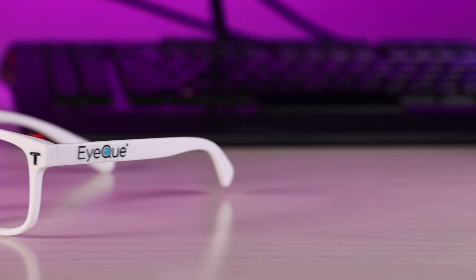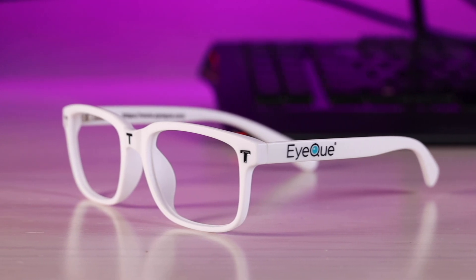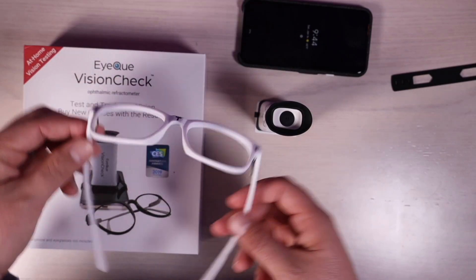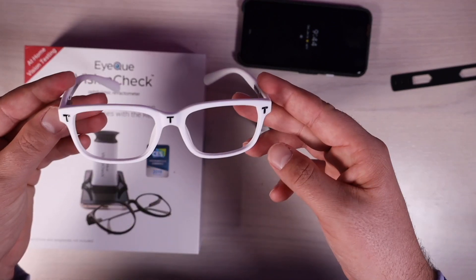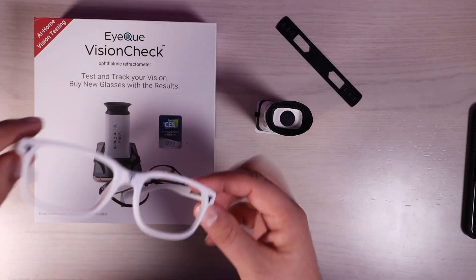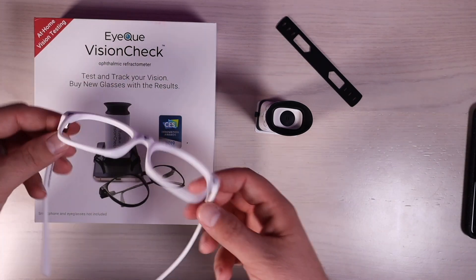And then you also have the pupillary distance measuring tool. Everyone's pupils are aligned differently and everyone's eyeballs are spaced differently on their face — everyone has a different facial structure. So this makes sure that your glasses support your specific pupillary distance.